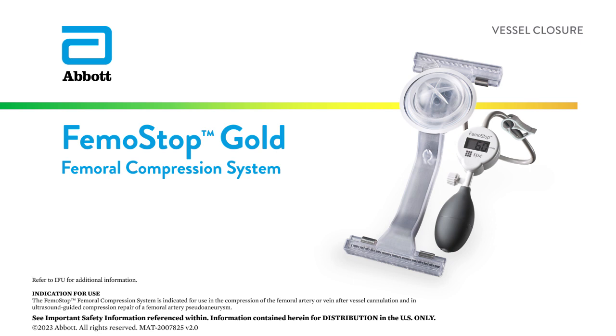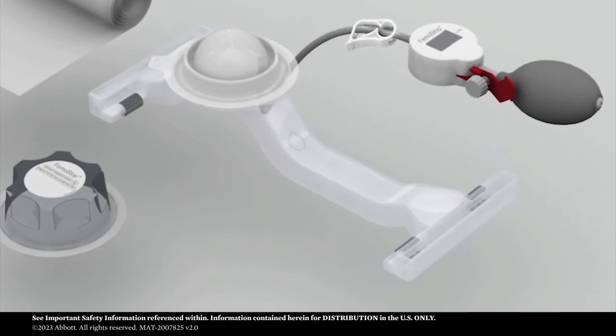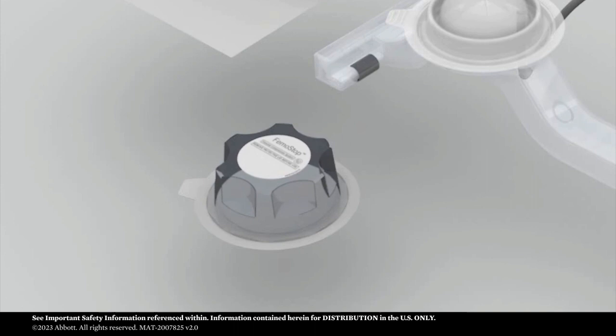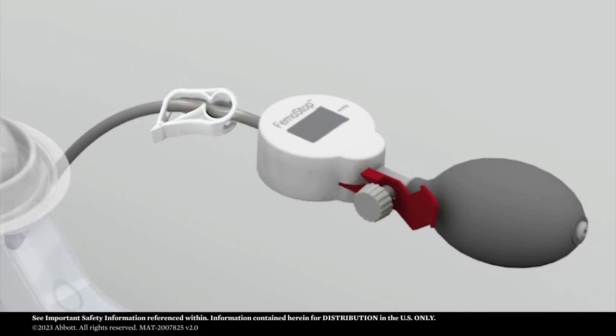FEMO Stop Gold is an external compression device that offers a comfortable, hands-free method of femoral artery or vein compression after diagnostic and interventional procedures. FEMO Stop Gold consists of an arch, a sterile pneumatic pressure dome, a belt, and an integrated manometer. The dome is protected by a cover to keep it sterile during handling. The new digital manometer is disposable and connected to the arch for ease of use.